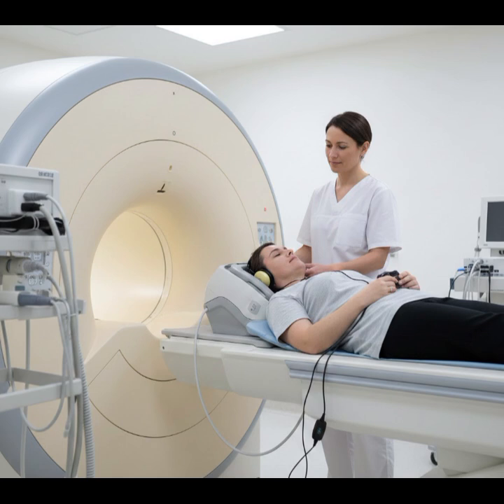For diffusion imaging, plan axial slices parallel to the line from the glabella to the foramen magnum. This angle helps reduce susceptibility artifacts near the skull base. Confirm full coverage from vertex to foramen magnum and maintain midline centering.